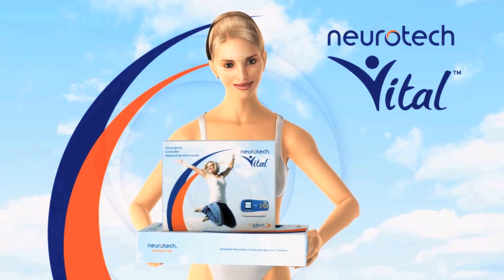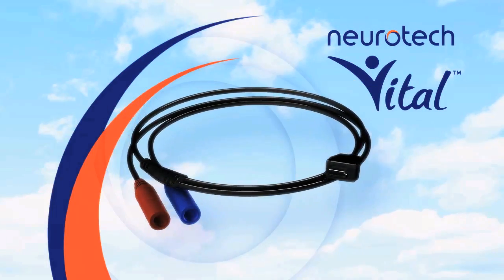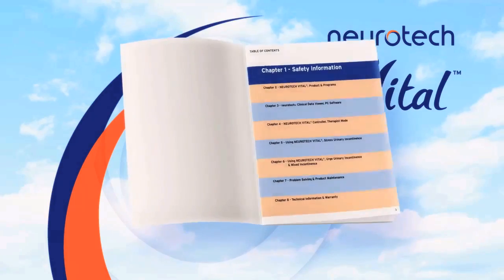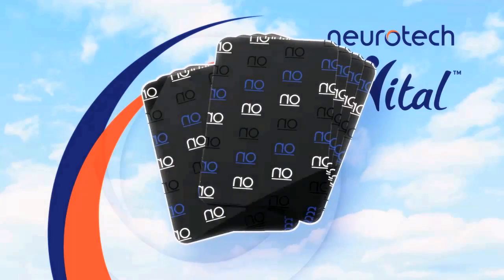Neurotech Vital comes in two packages. In the first one you'll find the device unit itself, the connecting cable, the charger and the instructions. Please read the instructions carefully before you start your treatment. The second package contains the two Vital thigh garments and eight electrodes.